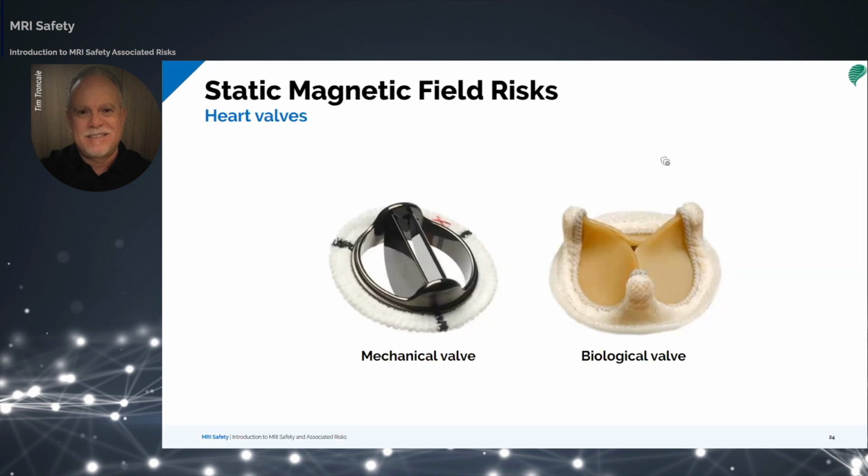An MR procedure is not considered to be hazardous for a patient that has any heart valve prosthesis or annuloplasty ring tested relative to the field strength of the MR system magnet used for examination.